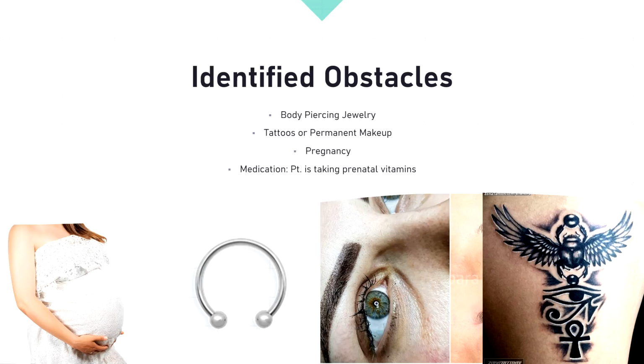Upon reviewing the form that the patient completed, we can identify four primary obstacles. The first one is body piercing, which poses a projectile and heating risk. The second is tattoo, which can cause RF heating or skin irritation. The third is pregnancy, as indicated by her use of prenatal vitamins. And the fourth is the contrast administration. Since the order is for a with and without contrast exam, her pregnancy status significantly impacts our ability to proceed.